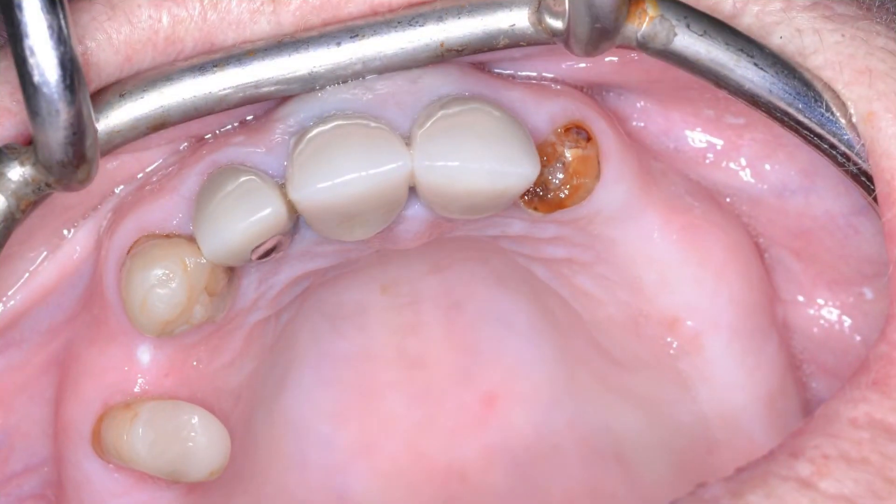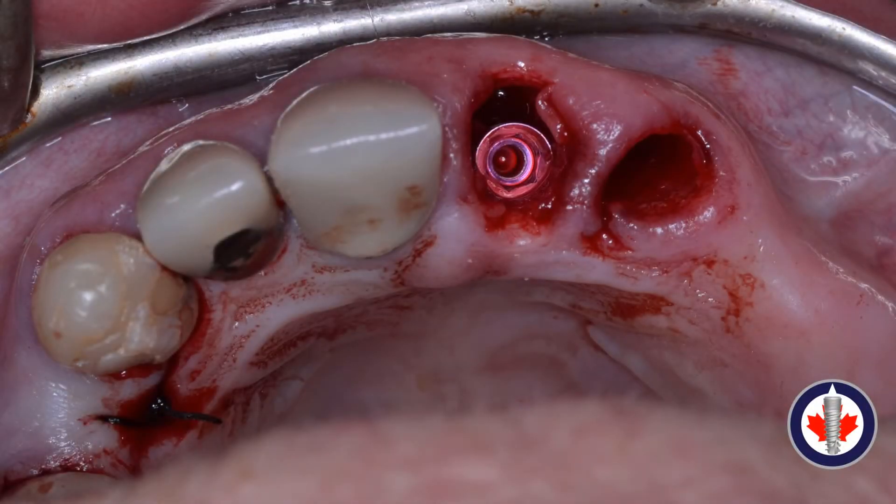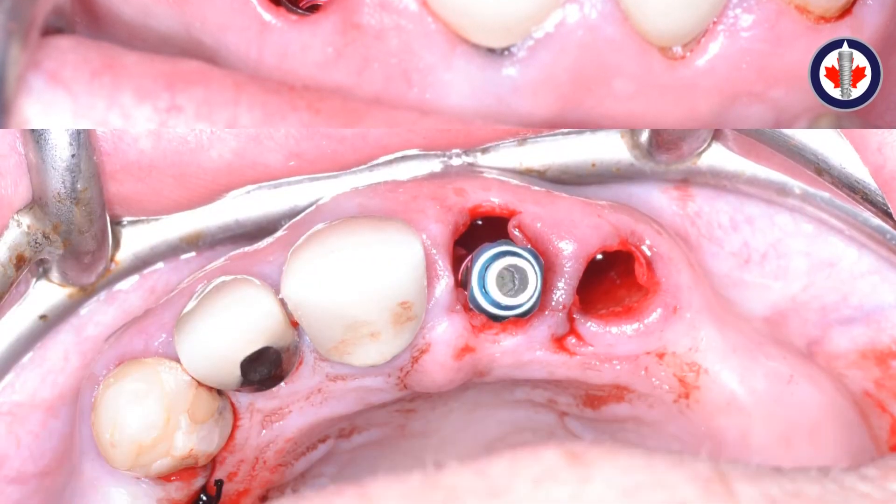Here we can see the patient from the occlusal perspective following removal of the maxillary left central and lateral incisors. On the maxillary right, implant surgery has already been performed and a suture is retaining that implant in place. We use precision and pilot drills to obtain our initial osteotomy in the maxillary left central incisor in the dense palatal bone, trying to get a screw-retained position. The implant is placed about three millimeters from the proposed gingival margin to achieve a nice emergence profile, so the tooth looks like it is naturally emerging from the tissue.